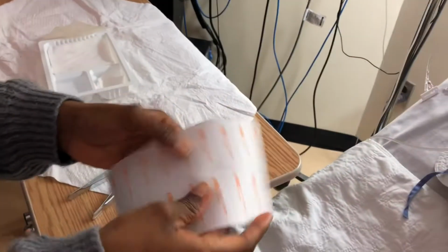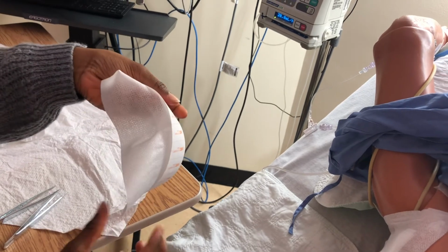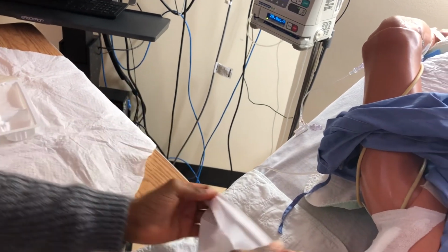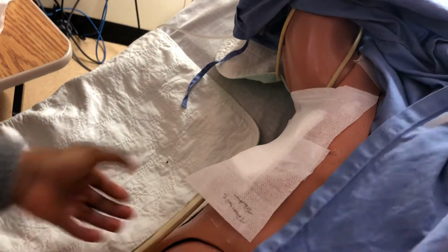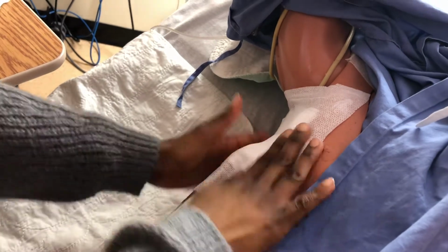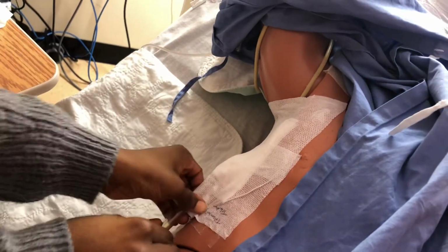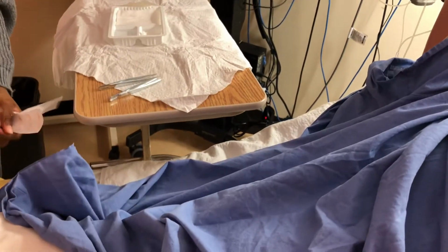And then I already made my label with my name and my designation and the dates. So I'm just going to go ahead and cover this. So this has to be fully occlusive, and I have to make sure I tent it by the tube. So if it gets pulled, it's only pulling on this and not the actual tube. So, and then I'll take this and then make it tent just so that in case they pull it, it's not pulling on the tube itself. So it's gonna be pulling here instead. And then I'll go ahead and document and put the patient in the position where they would like to be and do my exit safety check, and that's it.